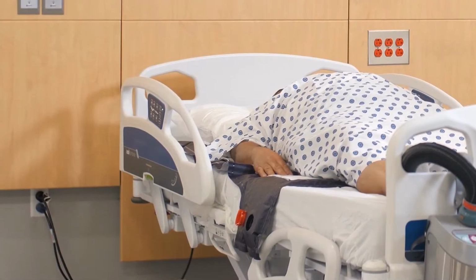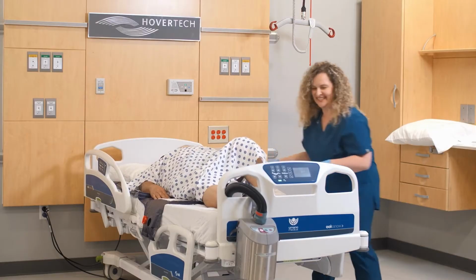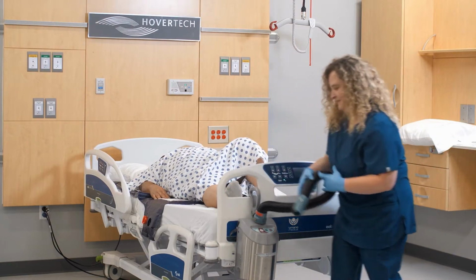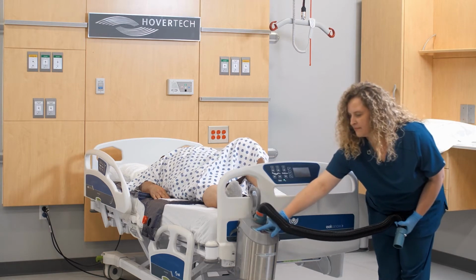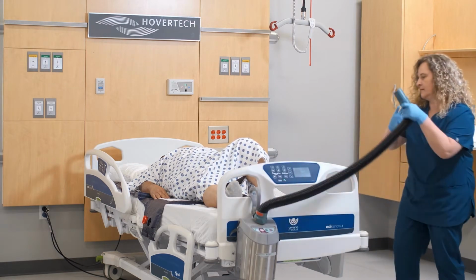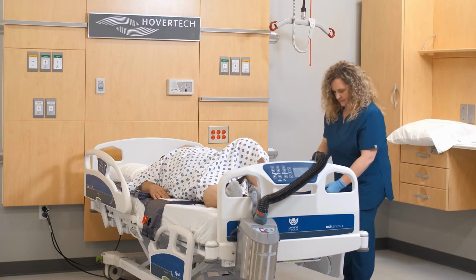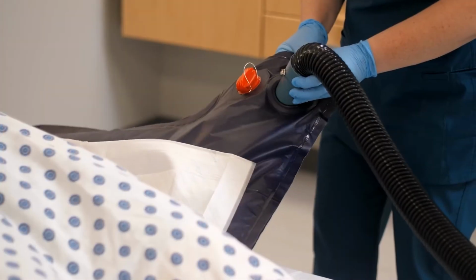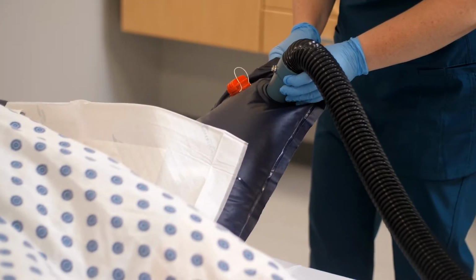Raise the side rails and bend the patient's knees to a comfortable level to assist in turning. Press the adjustable speed on the air supply 2 times to gently inflate the chamber. The button may be pressed up to 4 times for additional airflow. Press the hose against the black inflate valve. The chamber will begin to inflate and the patient will turn.